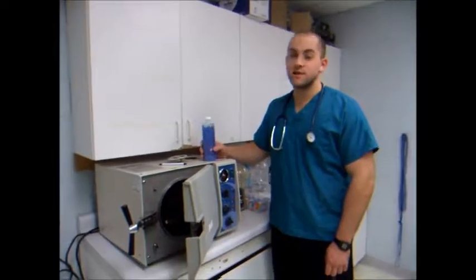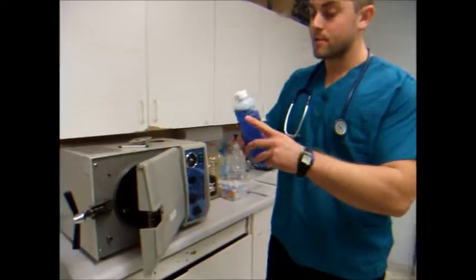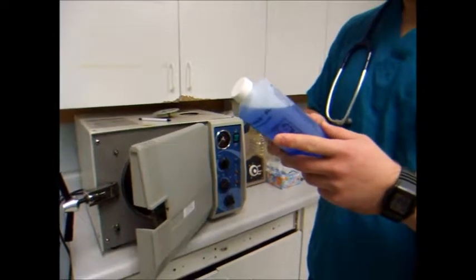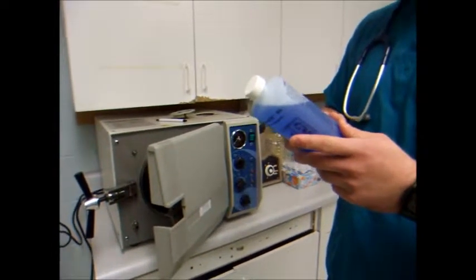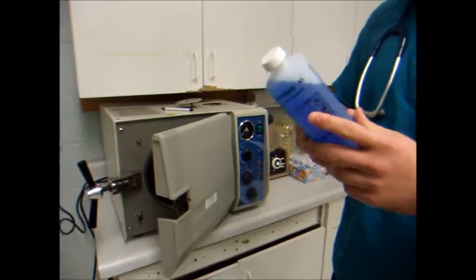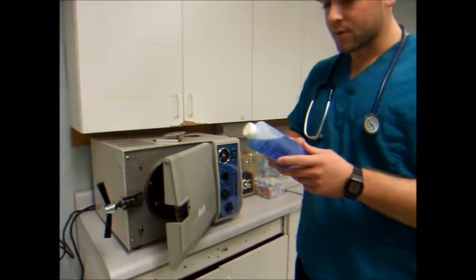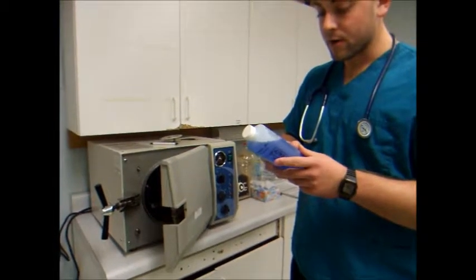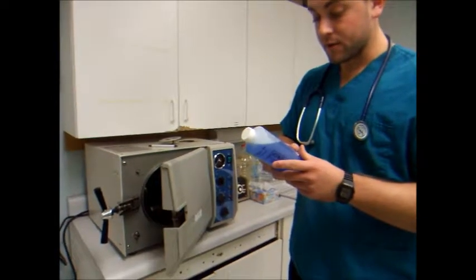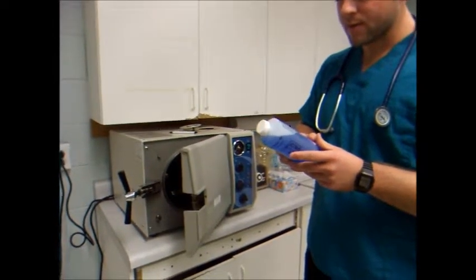I'm going to go over how to maintain the autoclave, so we're going to go over how to clean it here. This is the cleaner that we've got. So what you're going to do is you're going to mix 6 ounces of it with 64 ounces of distilled water. You're going to drain the reservoir and fill with a cleaning solution. You're going to run a normal cycle, and instruments should not be in there while you're doing it. Drain the cleaning solution from the autoclave and the reservoir. Rinse thoroughly until water runs clear, and then you run the reservoir again. Drain, rinse solution, remove the tray rest and wipe out inside of boiler and tray rest.